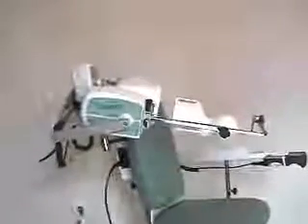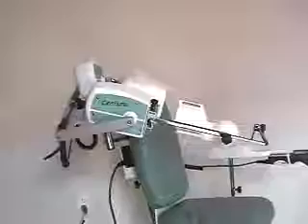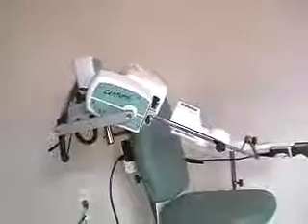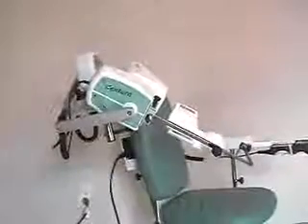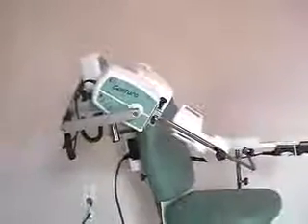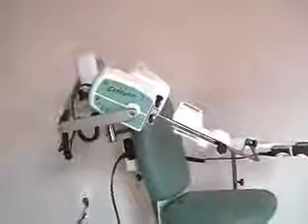Just as you saw, we can do abduction and adduction with the arm held in any particular degree of rotation, internally or externally. You can also put the first motor at any given point in the abduction range and then stop it there.